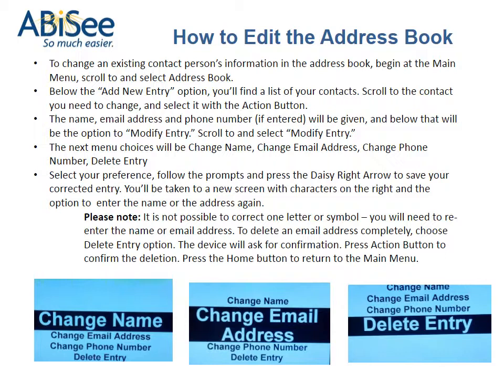To delete an email address completely, choose Delete Entry option. The device will ask for confirmation. Press Action button to confirm the deletion. Press the Home button to return to the main menu.